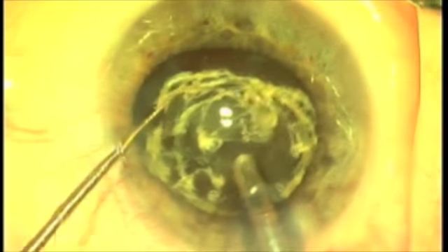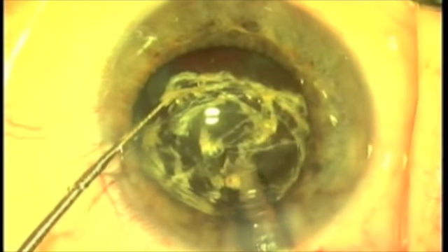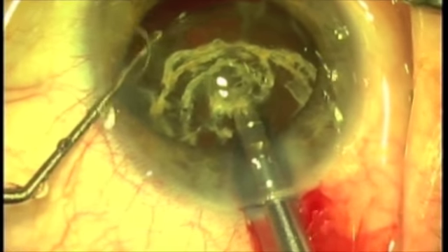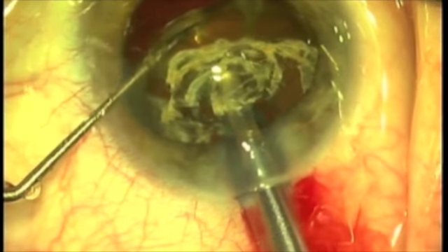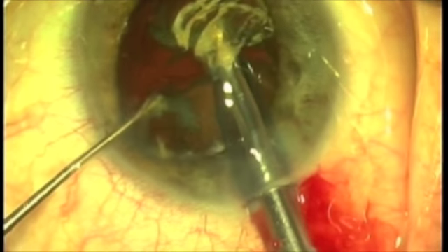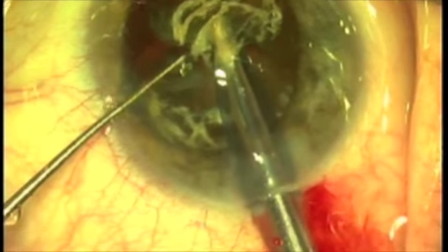Coming in now with a manipulator and cracker, and I'm cracking the nucleus. I want an even larger crack, so I'm going a little to the right, grasping the nucleus and again bringing the cracker in — and there we go, crack. We crack the nucleus into large segments.